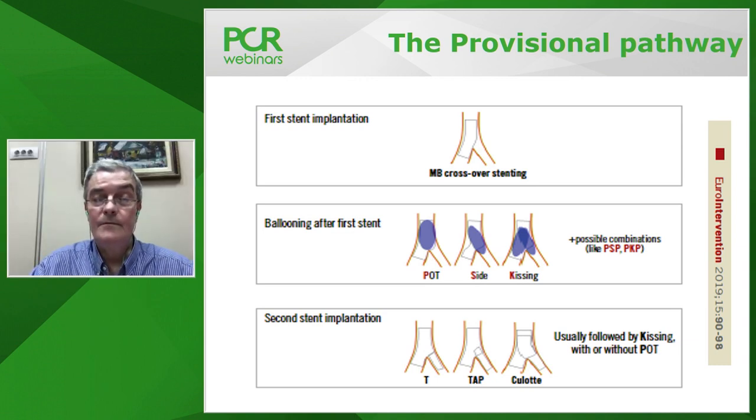Yeah, thank you, Jens. This was really a very educational, very didactic presentation. And thanks to illustrations which were prepared by Francesco Burzotta and his team, we can really share with our community the step-by-step performance of provisional stenting. We received in the meantime several questions. And before we move into the procedure, I will ask a couple of questions to both of you. So please choose which one you would like to answer. When we saw the basic anatomy, the question is, would anybody consider CABG for this case?